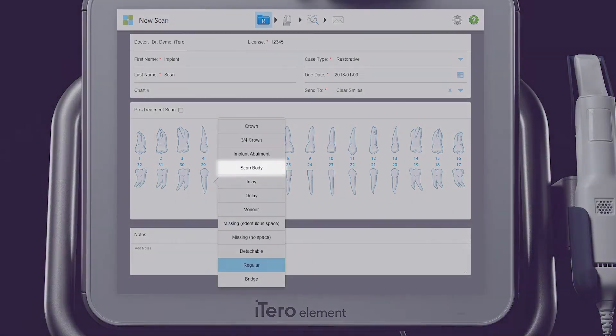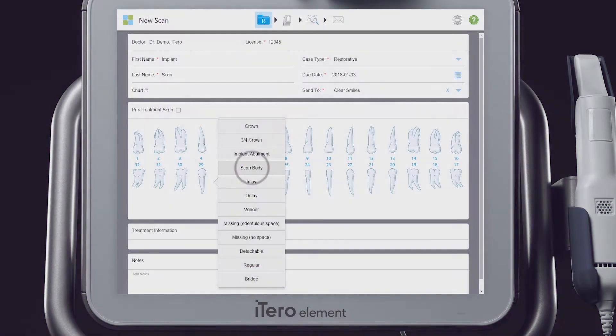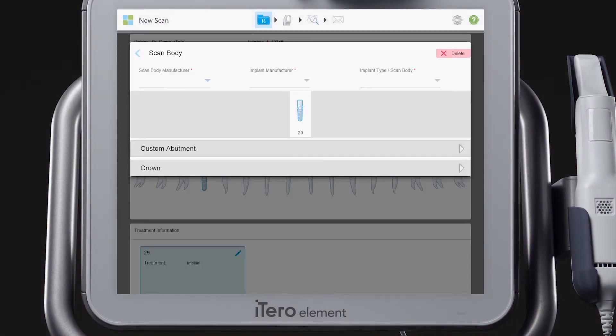Choose the tooth for the implant from the tooth chart. Select Scan Body from the list. A scan body is what we call a fixture level impression coping.